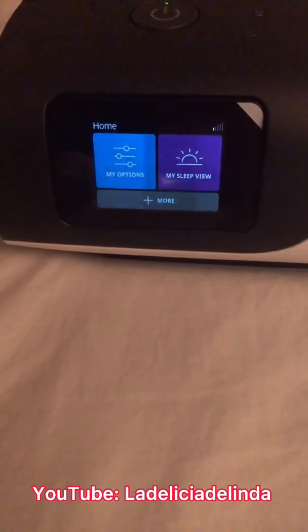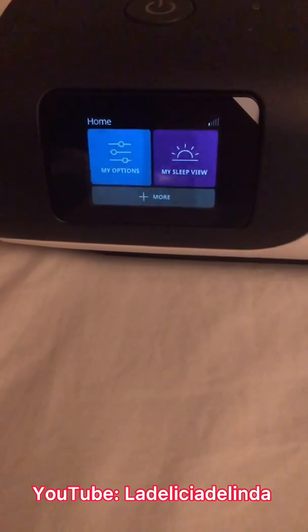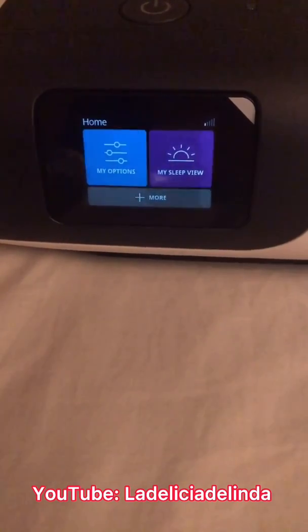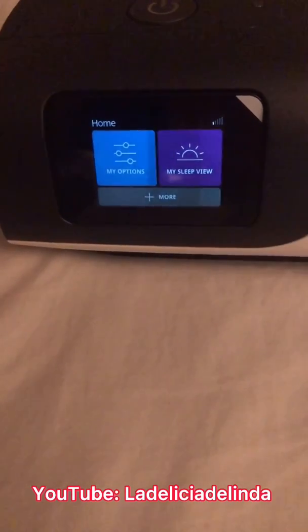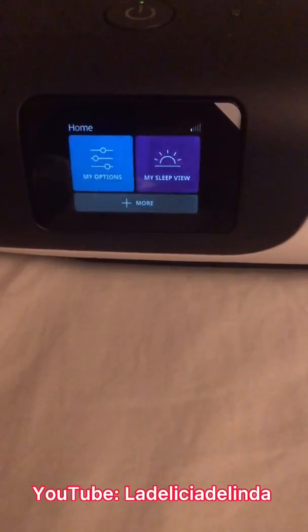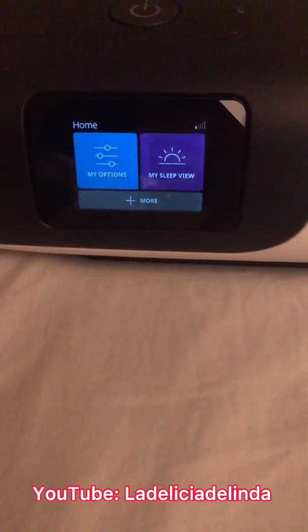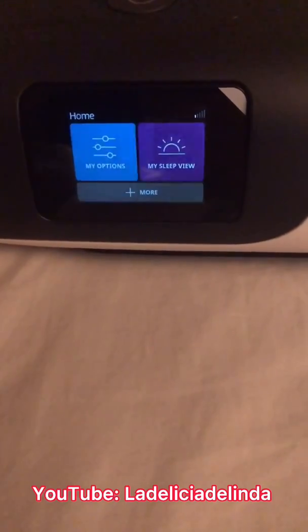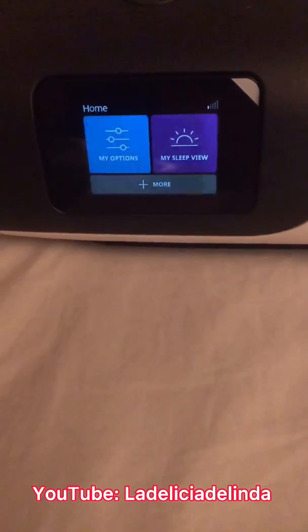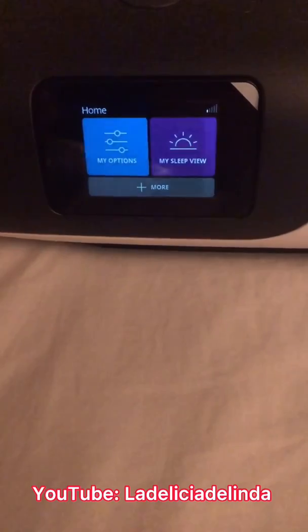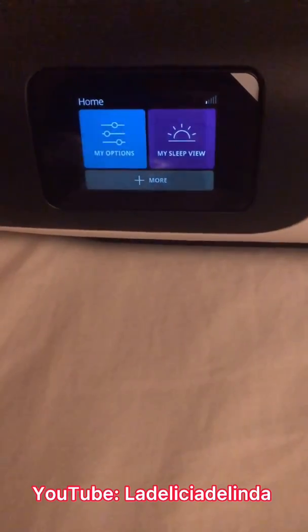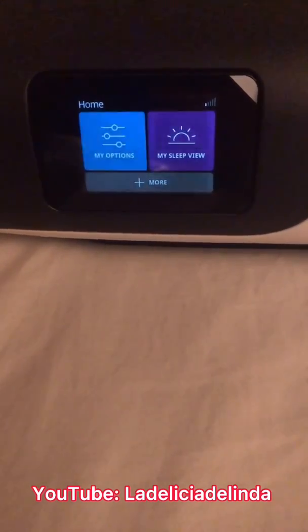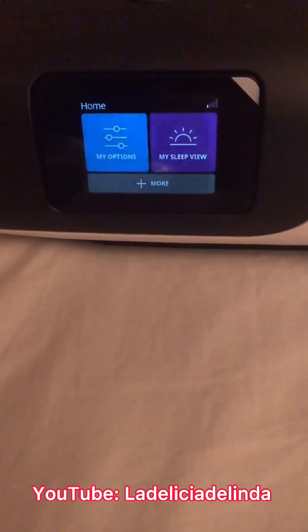To repeat the disclaimer: the clinical settings are usually meant only for your respiratory therapist or clinician to access, but some people like to access it for additional comfort settings they want to adjust on their own without having to go to their sleep apnea clinic.